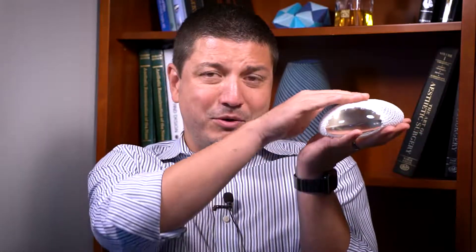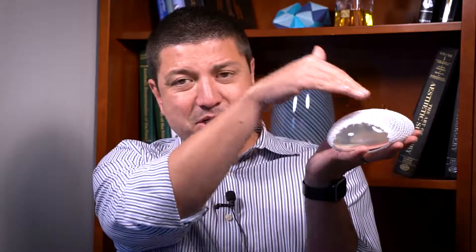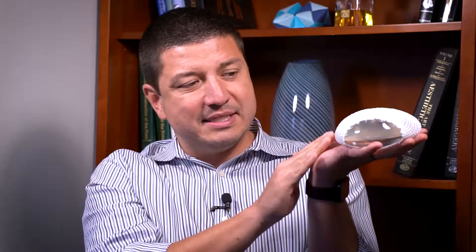One thing that often comes up in surgery is that as we get past the apex of the implant — the top of the mountain — and now we're going over into the dark side of the moon, as it were, this is the part that you can't really see. This becomes much more challenging and difficult to keep everything together. As you get about halfway in, if you then carefully and completely remove the implant and all the material, this allows the capsule to deflate and allows us to see the backside much more easily, where we can then remove the rest of that capsule as safely and efficiently as possible through the smallest incision possible, causing the least amount of damage to your natural healthy tissues and resulting in the least amount of deformity.